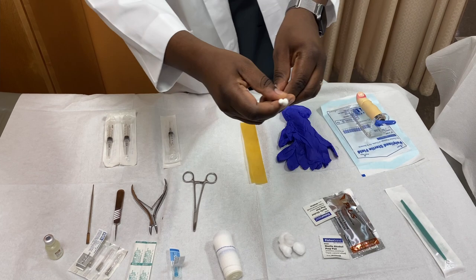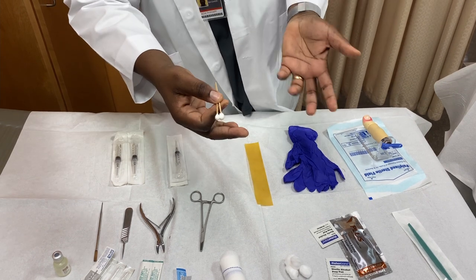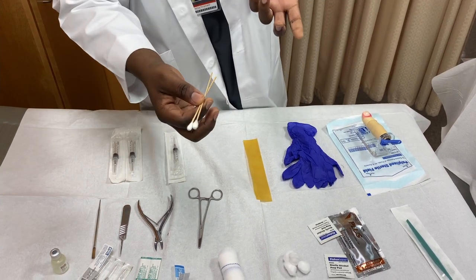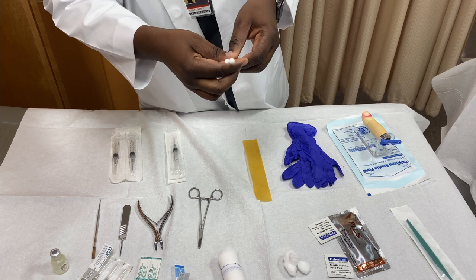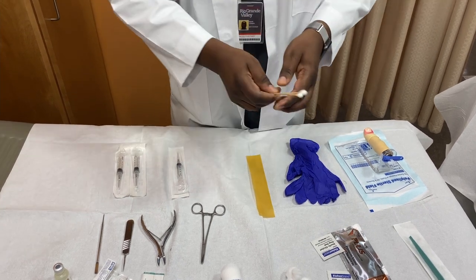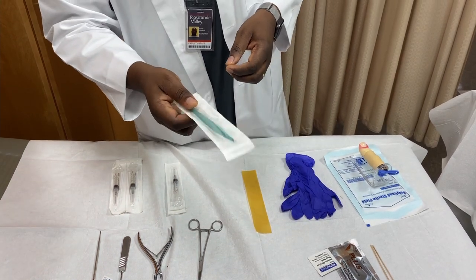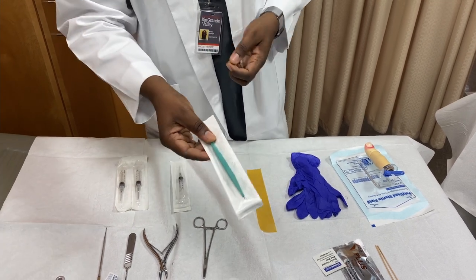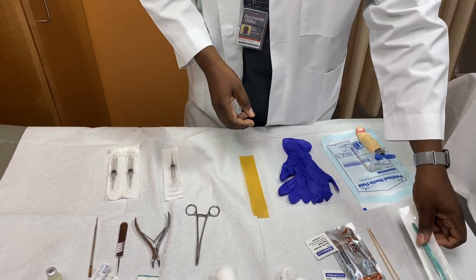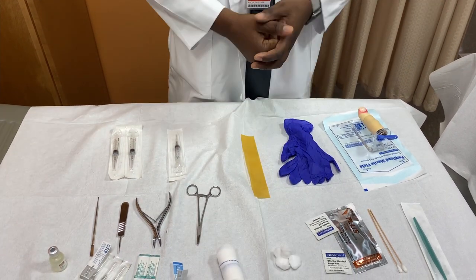You'll also need cotton wool applicators. If this is a second visit for toenail avulsion, you'll need to apply phenol to the sulcus on the lateral side of the nail on whichever side has the problem. On the first visit you don't remove all of the nail — if there's a recurrence, you tend to do a matrixectomy. Depending on the stage of ingrown toenail, by stage 3 you already need to remove granulation tissue — you can use a curette for that. Cotton wool can also help maintain a bloodless field if you're doing a matrixectomy.